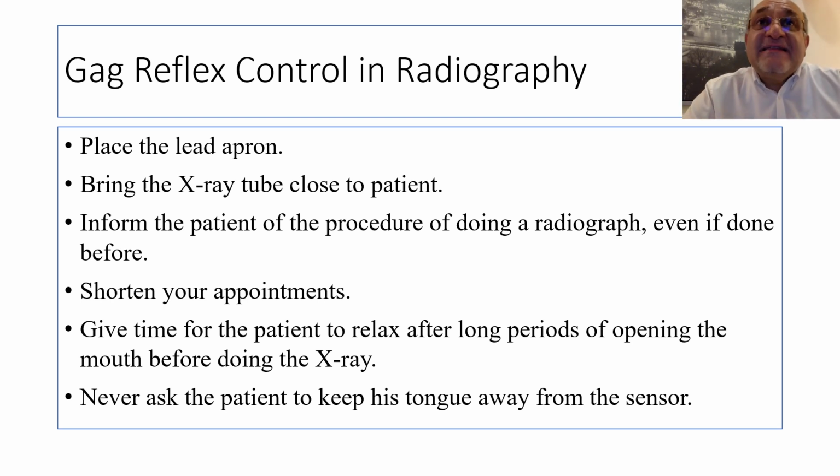And give the time, especially for a long procedure where the patient is going to open the mouth for a long period. This is going to increase the pain and discomfort in the muscles of mastication.